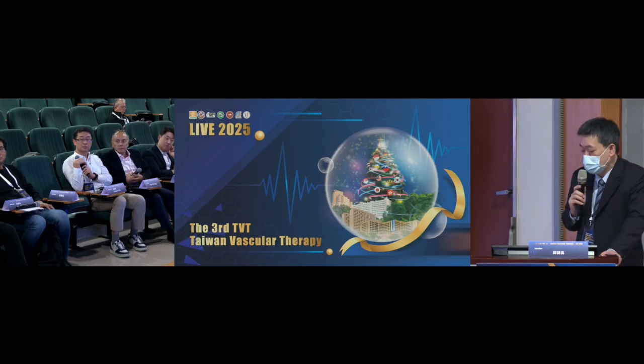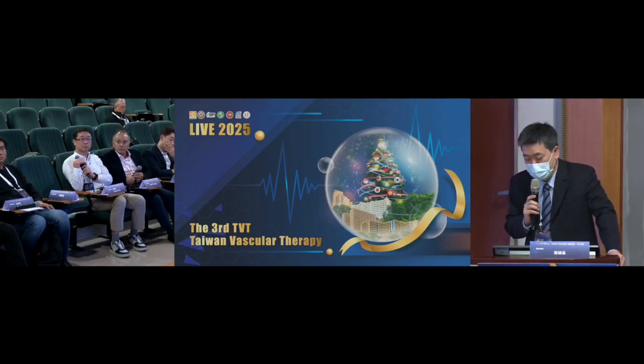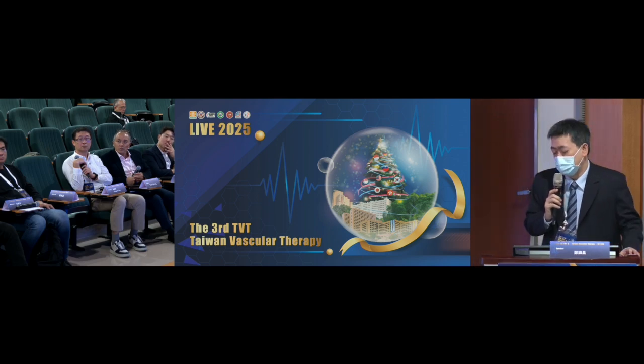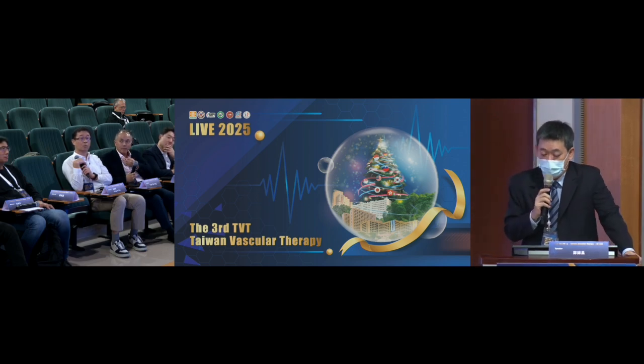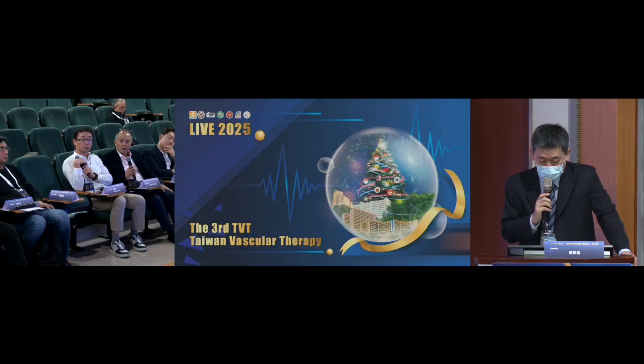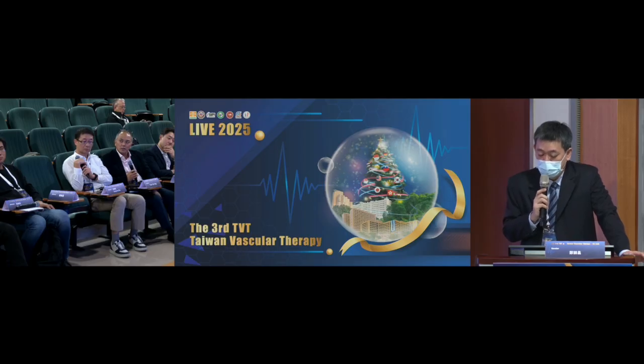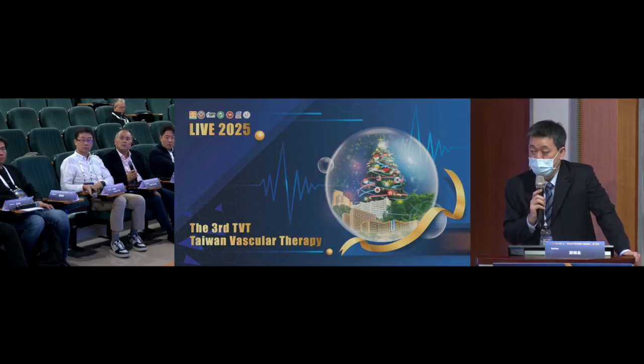The recoil rate is very low. According to the study, the recoil rate is less than 1%. Because in patients with CTEPH, the right lower lung is always affected, so I treat the right lower lung.